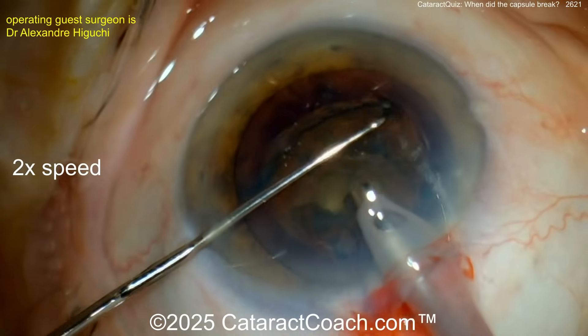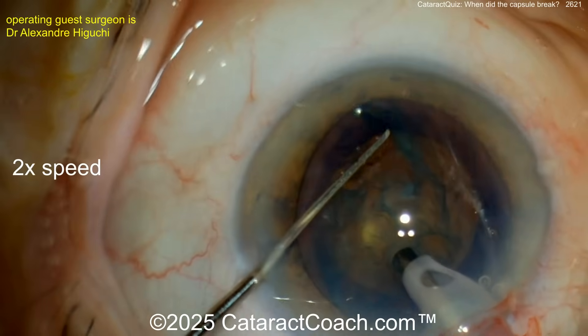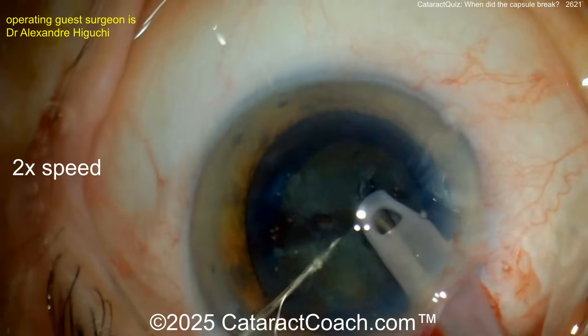Using a blunt tip chopper, rotating the nucleus around. Now let's see the chop technique — looks like a horizontal chop, performed safely because it's a ball tip chopper. That looks great — a beautiful chop.